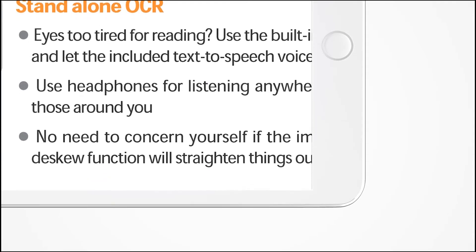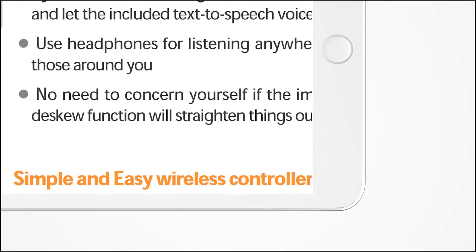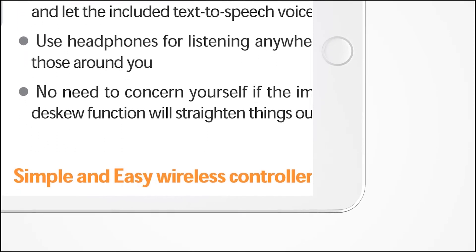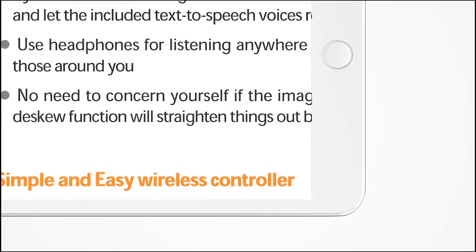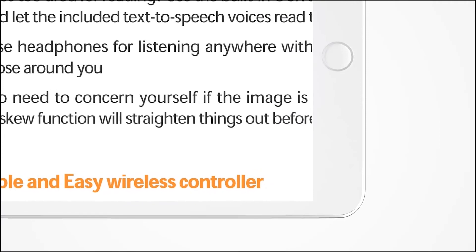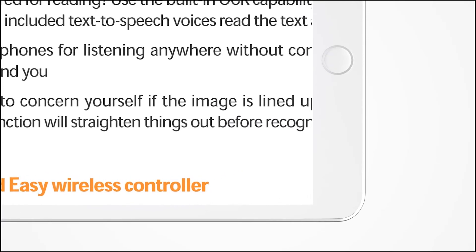eBot Advance reduces eye fatigue and increases comprehension by allowing the user to both see and hear the text they are reading.